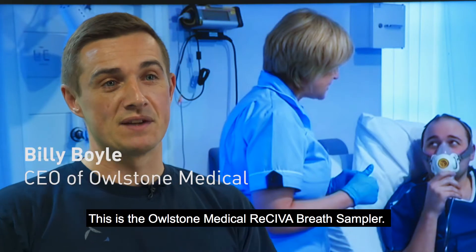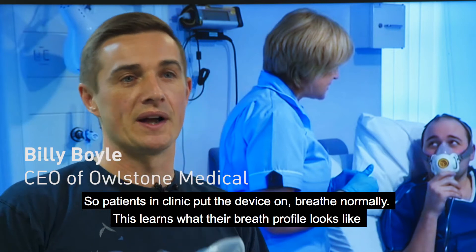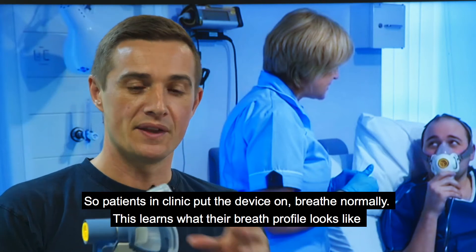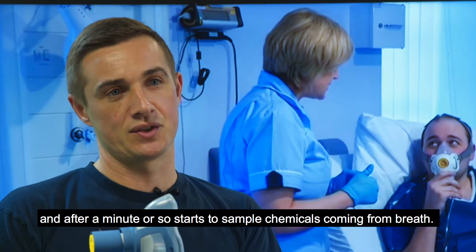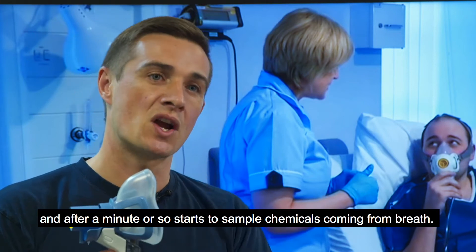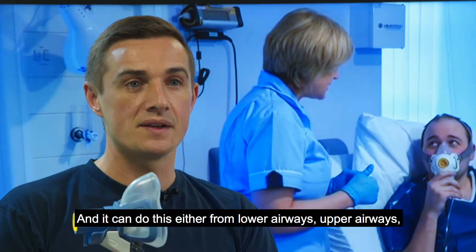This is the Owlstone Medical ReCIVA Breath Sampler. Patients in clinic put the device on, breathe normally. This learns what the breath profile looks like and then after a minute or so starts to sample chemicals coming from breath. It can do this either from lower airways or upper airways.